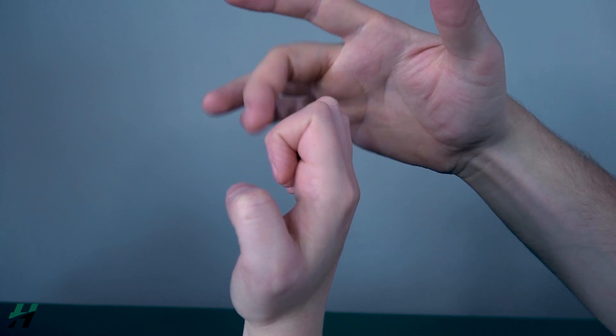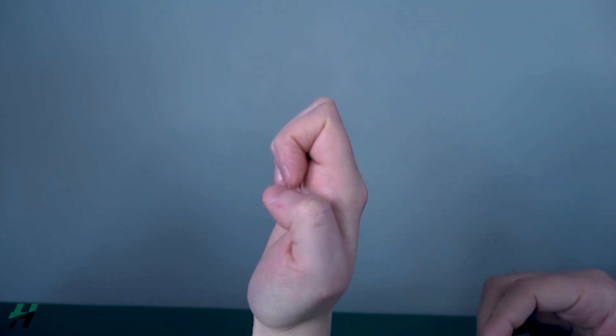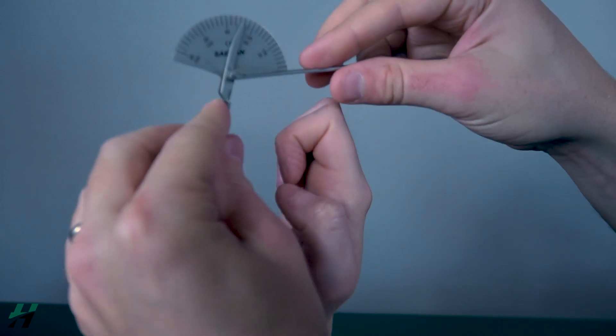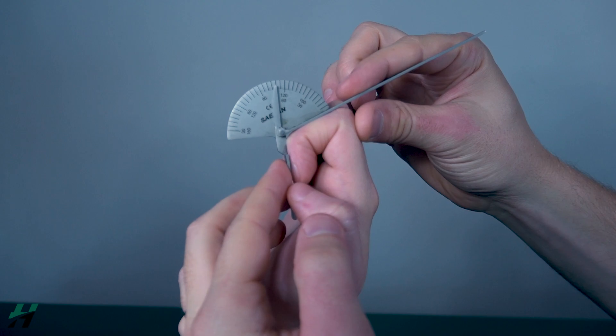To measure the DIP joint, you do relatively the same thing except this time you'll have the stationary arm on the middle phalanx and the movement arm on the distal phalanx, with the axis right over the DIP joint. Right here we're looking at 70 degrees.